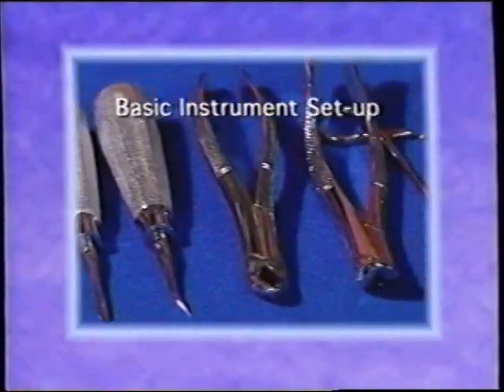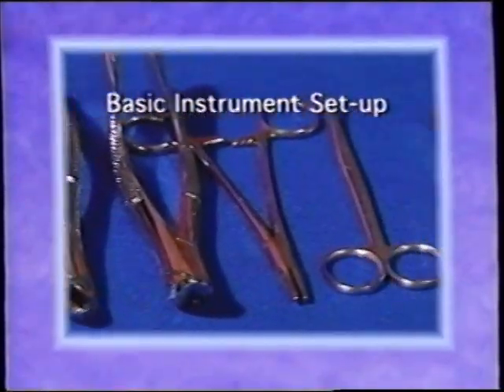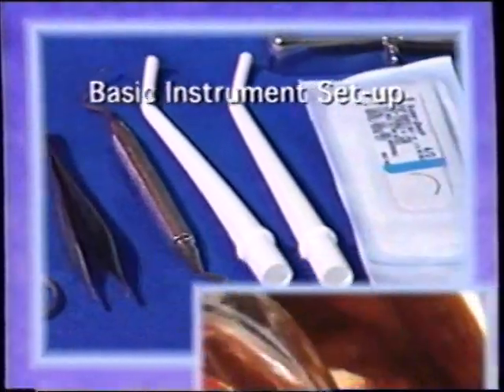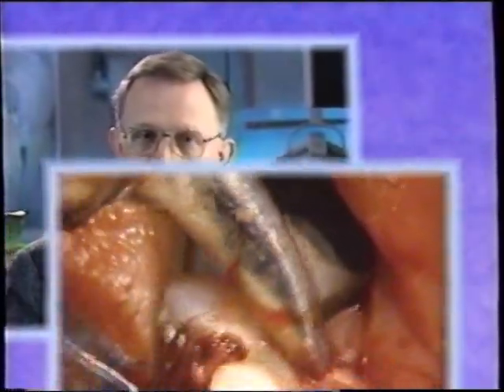Any of the extractions we have that have the potential for becoming surgical, we should have these in a tray setup. But we never can fully predict what's going to happen. Even those that look simple and straightforward can become fairly traumatic and difficult.